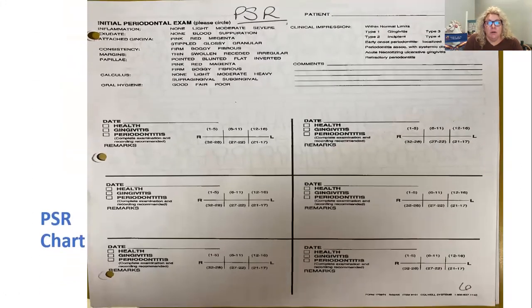This is a PSR. So we do a perio screening for people that aren't in periodontal disease, or we just take a general kind of check really quickly. And what they'll do is they'll probe teeth numbers 1 through 5 and take, like, if all the areas are 2s, they're going to write a 2 right here. Then they're going to probe 6 through 11.